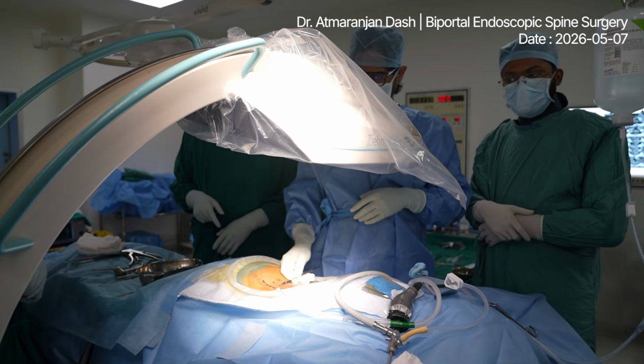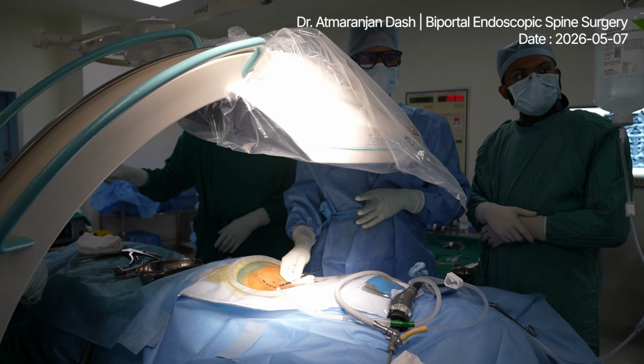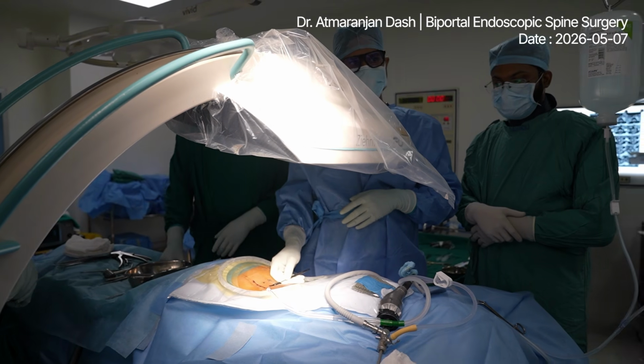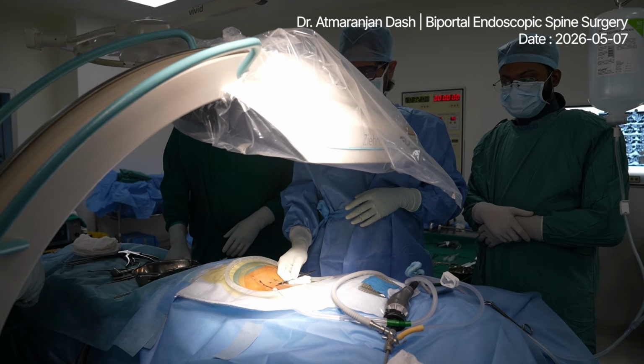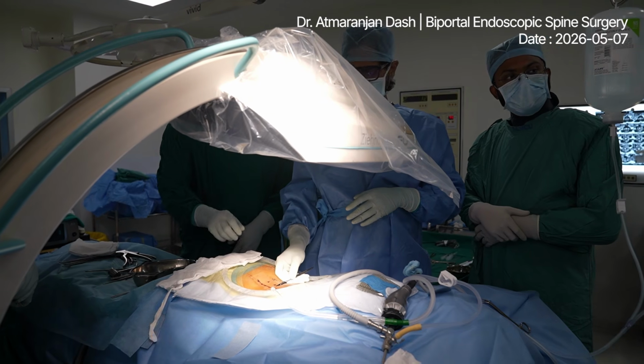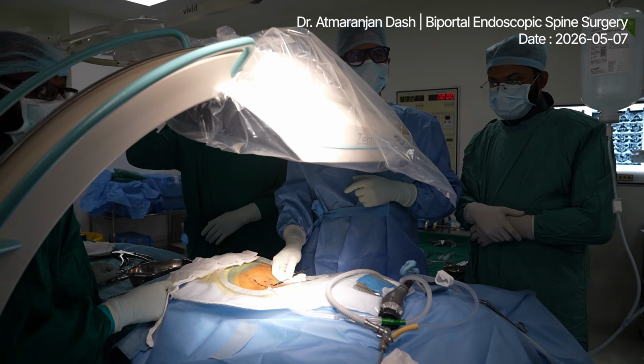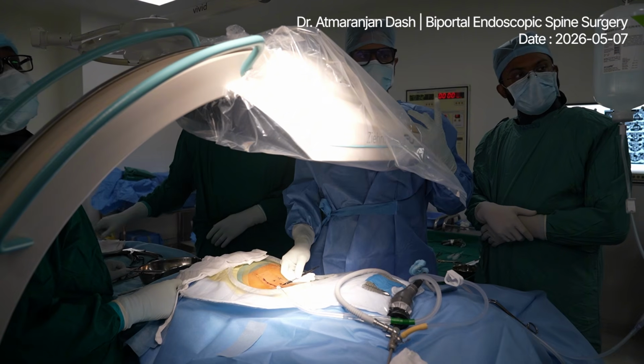So now we are going to operate a case which was operated previously, 5 years back. The patient had open surgery and is now complaining of radiculitis on the left side of the body, the left leg. So we are going to look at the foraminal area on MRI. We have a foraminal stenosis. Open surgery was done previously.